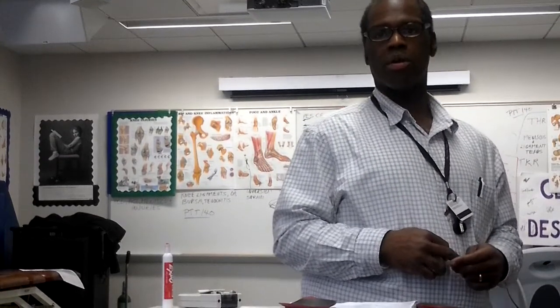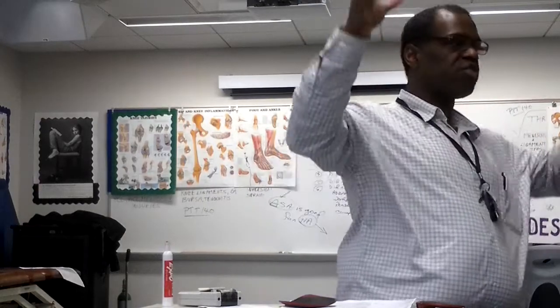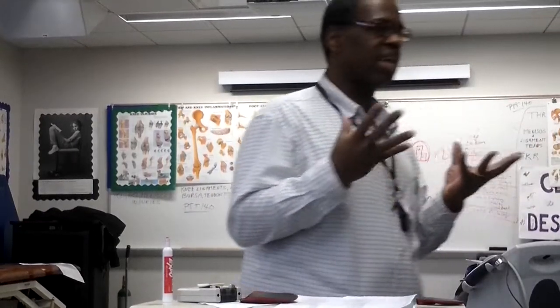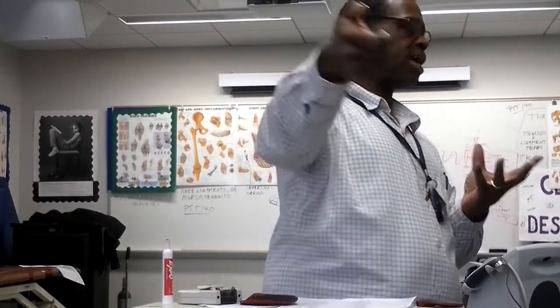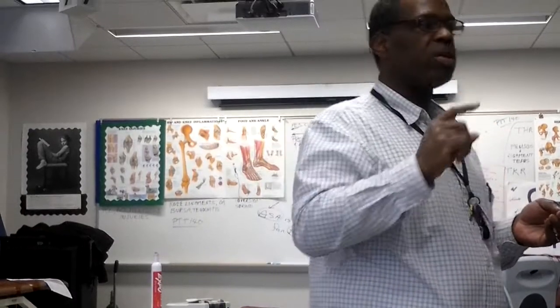Now, milliamps or volts. Really the only time we're concerned with knowing the exact number for the milliamps is usually when we're dealing with a wound care protocol that has a particular number they have researched and found works well for a wound. If you want a definition of milliamps or volts, it's really a force or pressure of electricity. So when we turn up the intensity, or the milliamps, on that machine, it's just a force or pressure of electricity that the person is given. That's all they get. Otherwise, the exact number we don't care about.